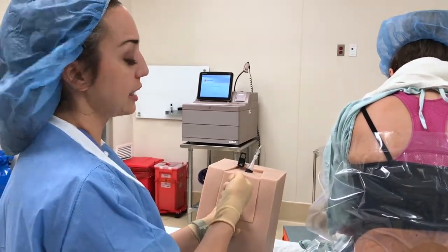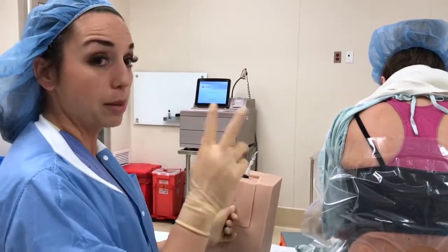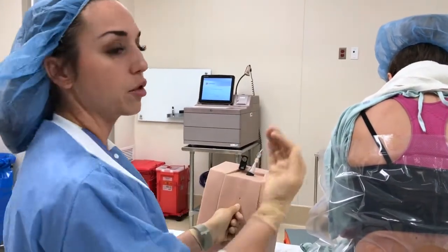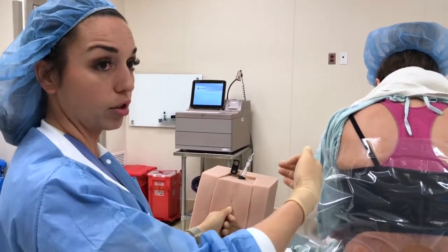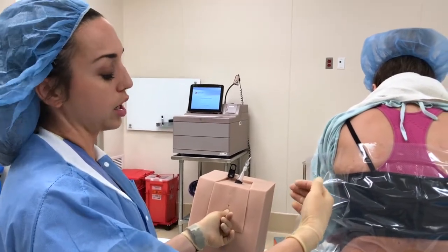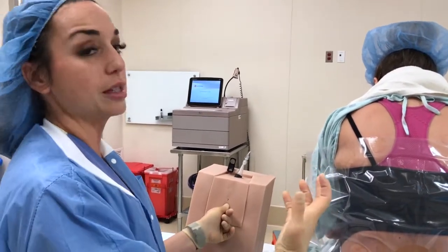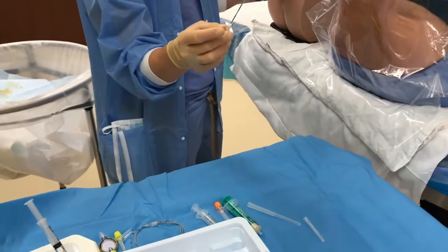After the interspinous, then you'll hit the ligamentum flavum, and that's typically what we describe as the pop sensation. And then after the ligamentum flavum, you're in the epidural space. After the epidural space, there's the dura mater that you'll encounter before you encounter the subarachnoid space for the spinal injection. Those are the layers. And then I grab my Tuohy needle.